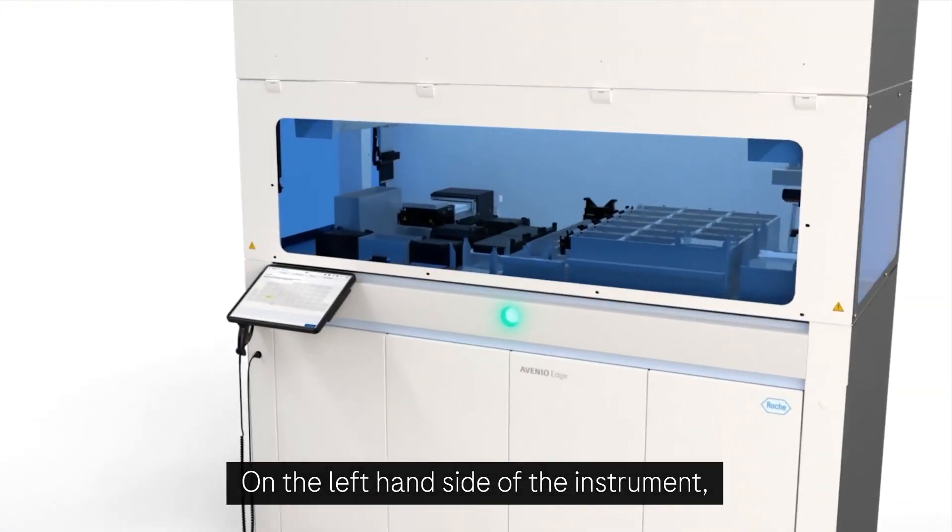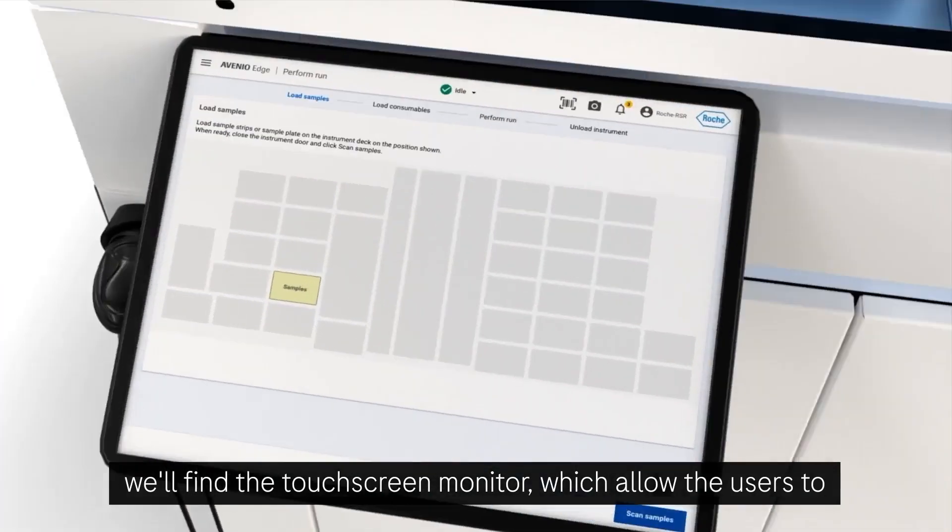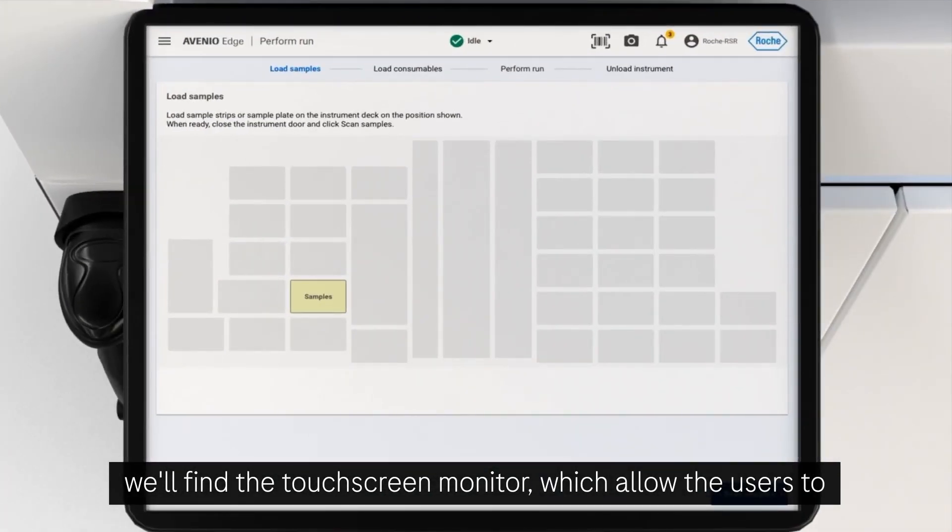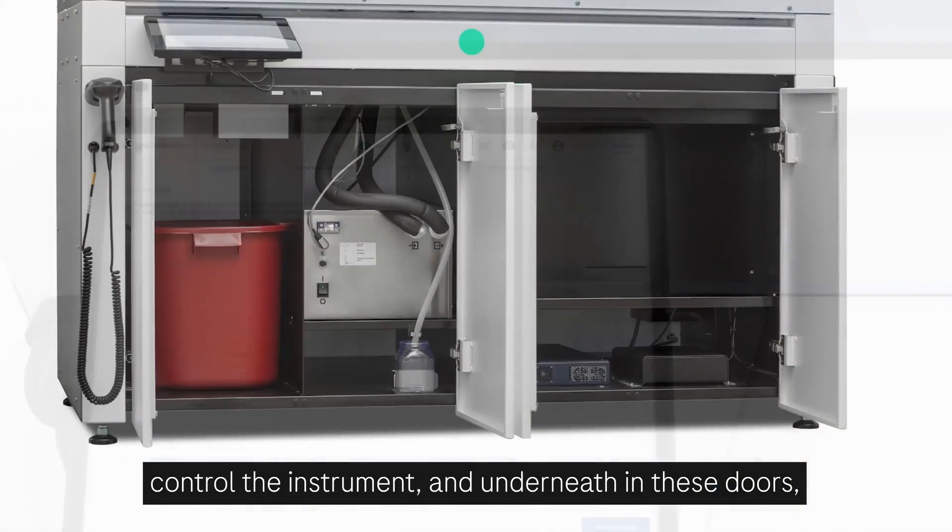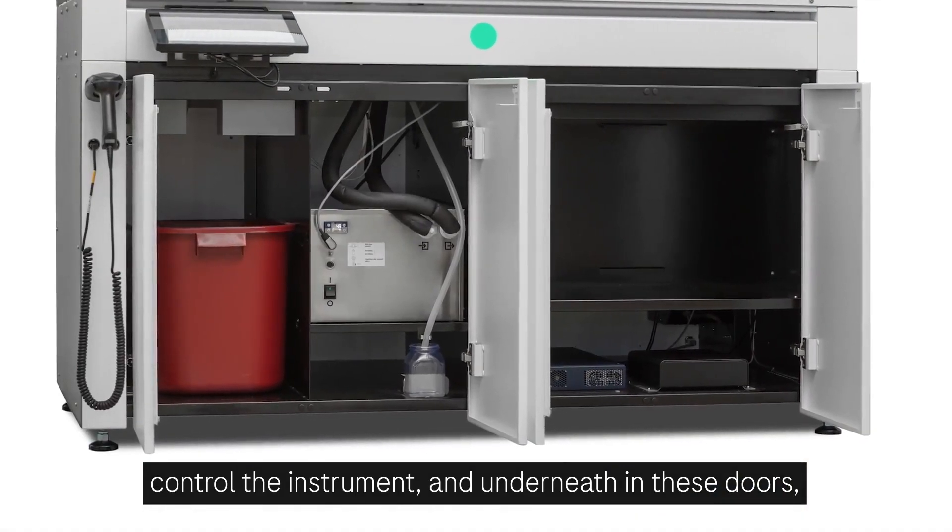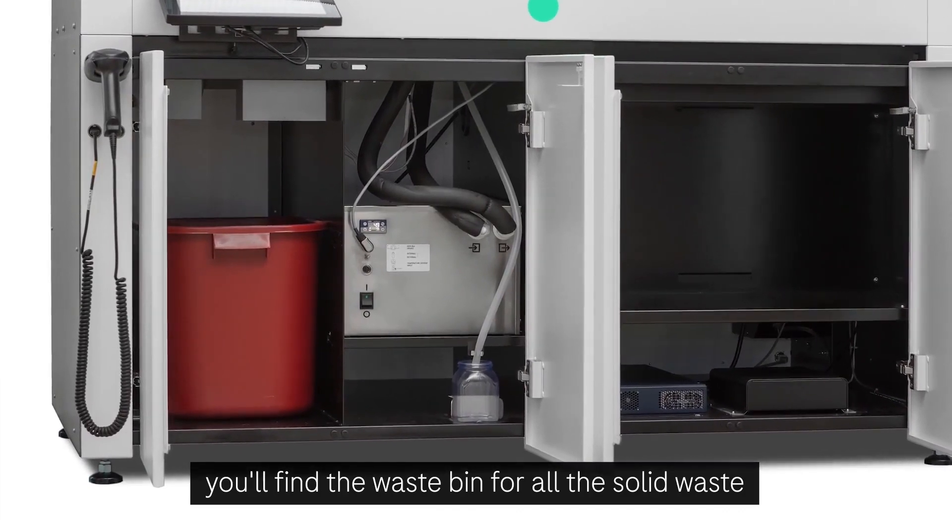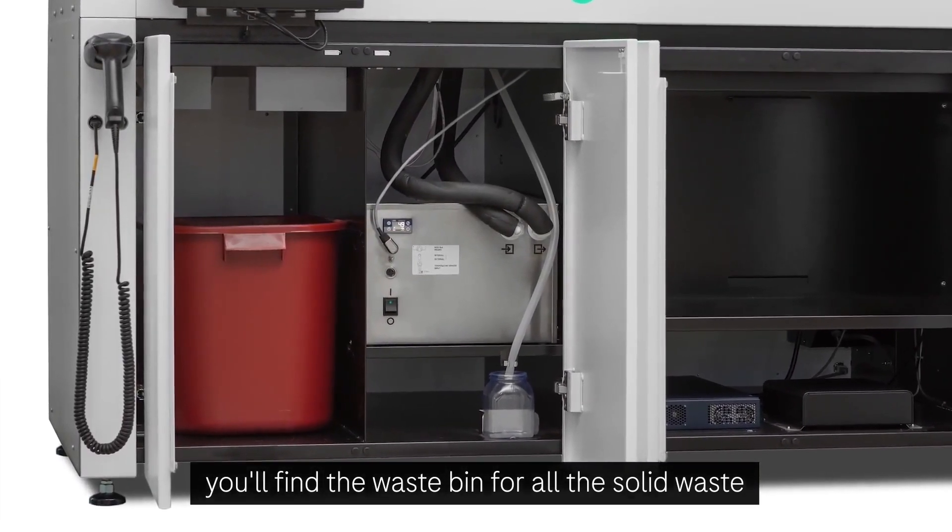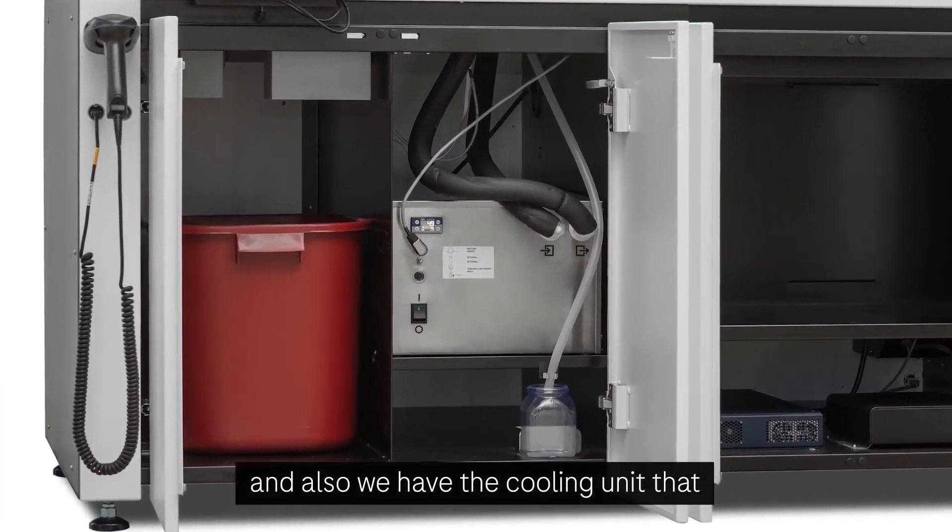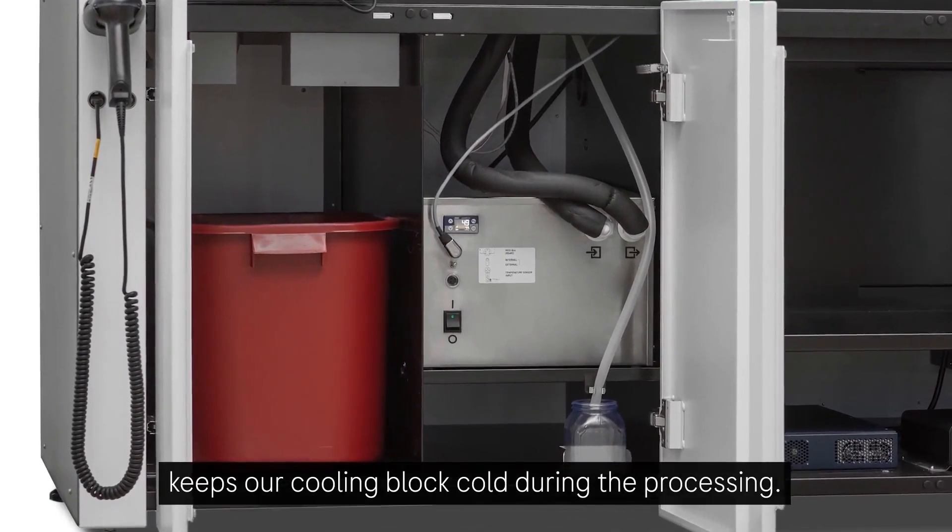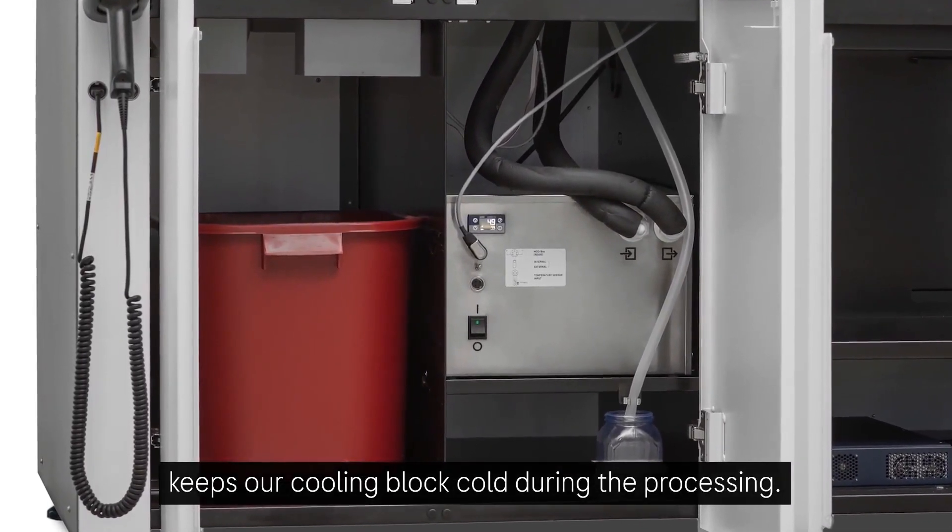On the left-hand side of the instrument, we'll find the touchscreen monitor, which allows the users to control the instrument. And underneath, in these doors which are locked during the processing, you'll find the waste bin for all the solid waste. And also, we have the cooling unit that keeps our cooling block cold during the processing.